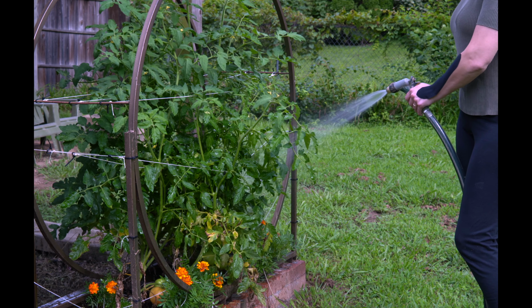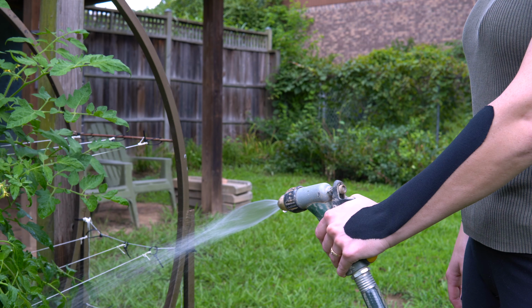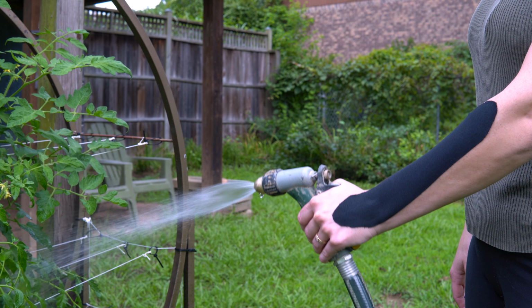It is important to remember Kinesio tape isn't a cure-all or a magic fix, but it can definitely help give your wrist a cue to bend back.